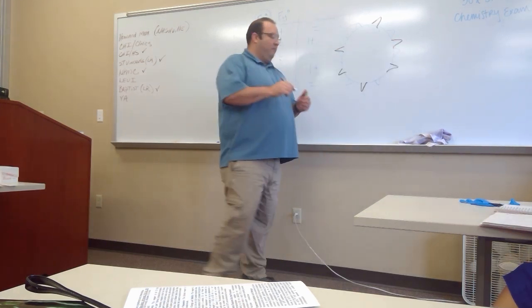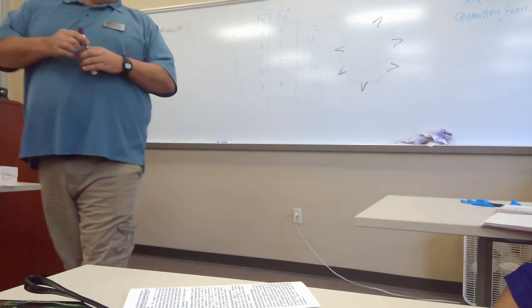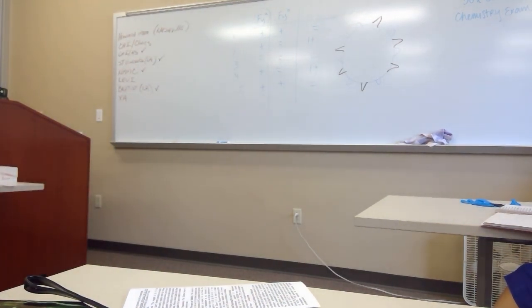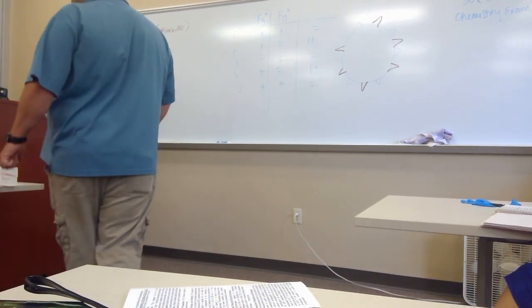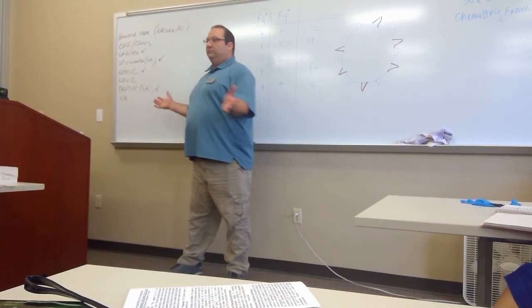So like I said, think of it that way if you have to. In this cell, there's less Duffy A available. It can't react as strong, therefore making the dosage smaller. Makes it weaker. Remember the weak D? When they just don't have very much antigen, you get a real weak reaction? That B being there is making this basically a weak Duffy A. It's not very strong. Does that help at all? Yes.